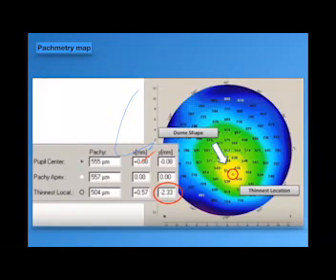If you find that they are all borderline, go to the topography again. If there is any abnormality in the topography, and go for the deviation of the thinnest location. If you find that all of them are borderline, you have to suspect this patient could be forme fruste keratoconus. Forme fruste keratoconus is diagnosed when you have abnormal topography with borderline maps in the pachymetry map and the elevation map.